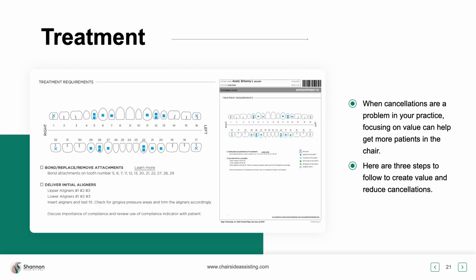But when they come back, we want to monitor the treatment. Some practices will give 3 aligners, some will give more. We really follow the ClinCheck because we're a general practice and we like to follow the rules. We're also very protective of our patients. You don't want to give these patients too many aligners, because if you give them too many aligners, we lose track of where they are. And if they're not compliant, then guess what? We have to rescan and start with mid-course correction. I don't want to do that. So we try not to give too many aligners. We usually give about 3 at the most to our patients. We try to follow the treatment plan and really do the best we can.